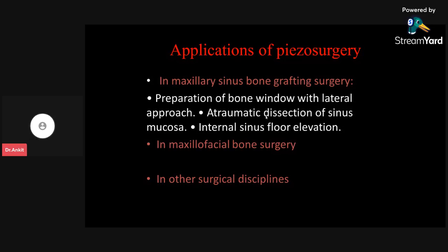And in other surgical disciplines, be it orthodontics, if you want to do rapid acceleration using the piezotome, you can cut the buccal cortex of the impacted tooth, and you can put your braces or activator to keep it aligned with the remaining teeth. This is a very important principle. And in other disciplines like neurosurgery, where you need to take a calvarial graft, and in orthopedic surgery, you can use it. And in other surgical disciplines like pediatric surgery, you can use it, right?